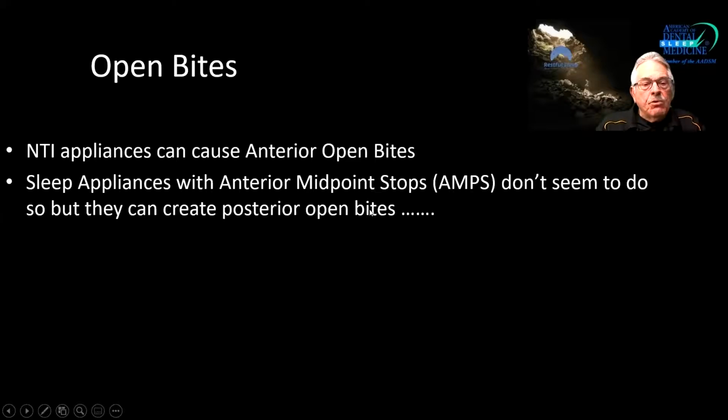They can create posterior open bites, okay? So you've got an NTI appliance which can definitely create anterior open bites, and I'll show you a case on that. But don't let that make you fearful of putting an anterior midpoint stop on a sleep appliance, because of the traction of the appliance, we don't see anterior open bites with anterior midpoint stops on sleep appliances. So if you're not going to use an anterior midpoint stop, that's fine, but don't avoid one because you think it's going to cause an anterior open bite, because I'm going to tell you it's not.